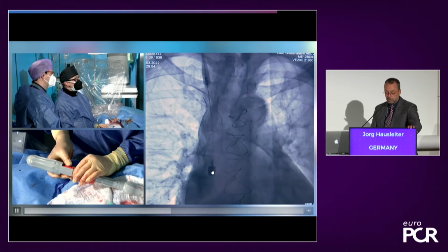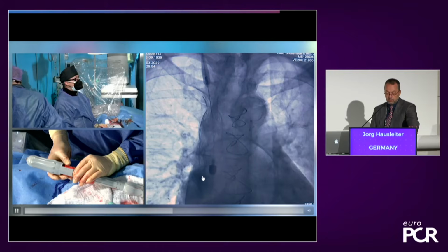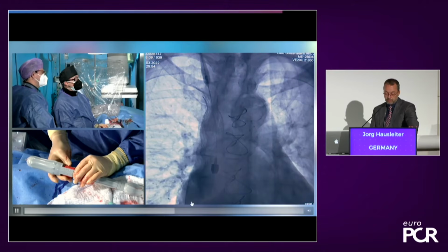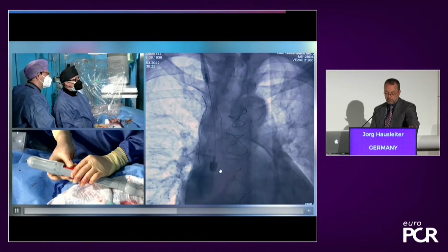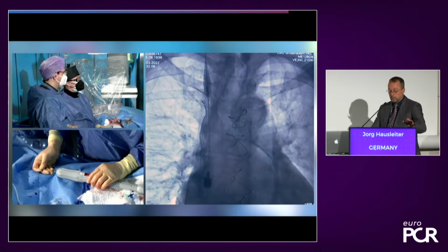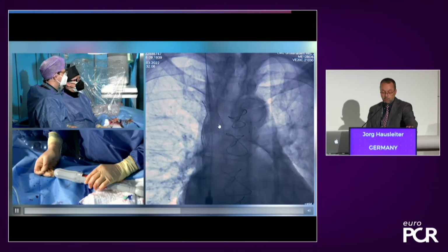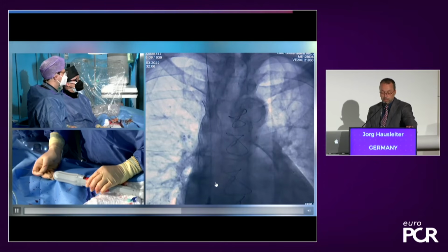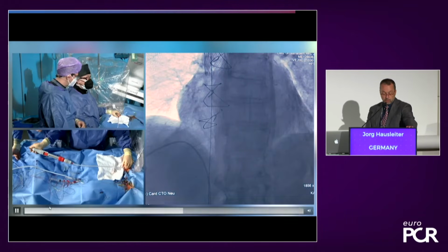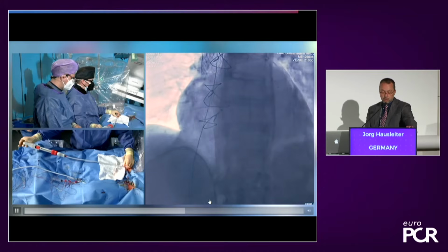and then you place this very carefully, one anchor after the other being released. Here one anchor is in, but the other two are still in the system. Now the other anchors came out at this point. Again, we have to wait a little bit, like a minute or so, and then we can slowly retract this catheter system. We don't want to put any tension on the stent, of course, so that it is not dropping into the right atrium.